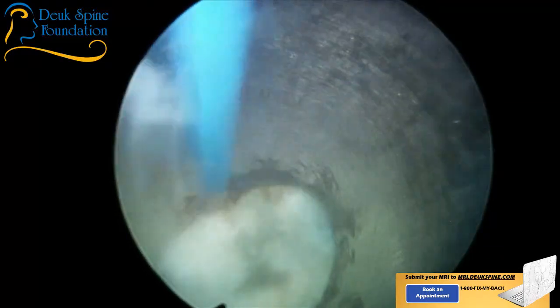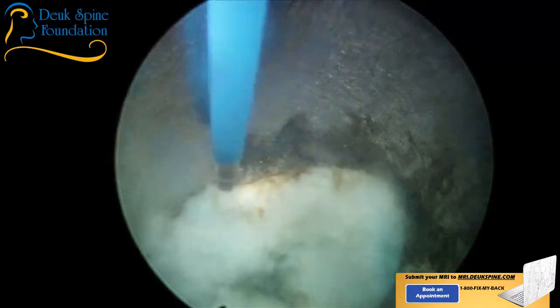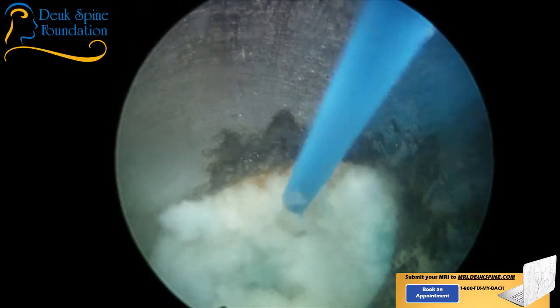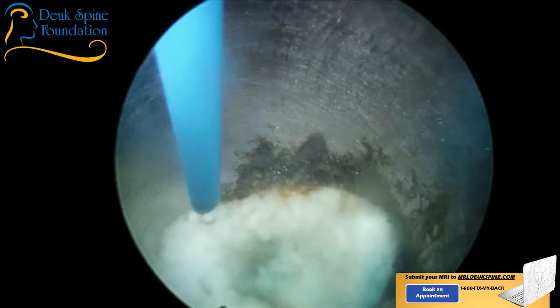And you can see there's no bleeding because the disc itself is avascular, especially where we are in the disc, the inside of the disc. There's no blood supply. Avascular means no blood supply. There are only a few tissues in the human body that have no blood supply.